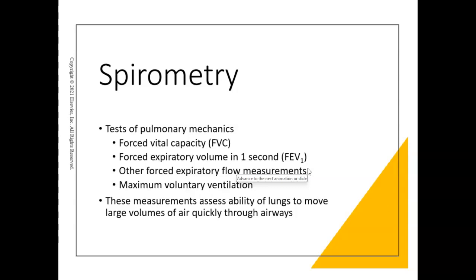So we instruct the patient to take a really big deep breath in, then exhale forcefully and completely. You tell the patient to blast it out, keep blowing it out until they've completely emptied their lungs, and then take another deep breath in.